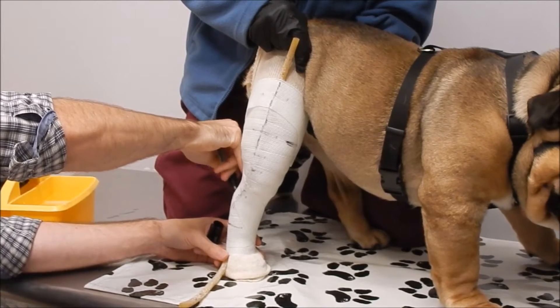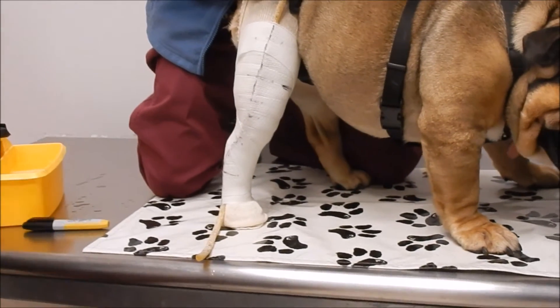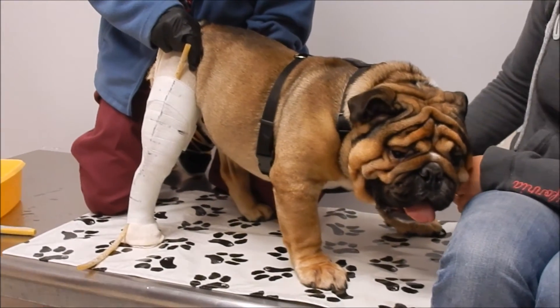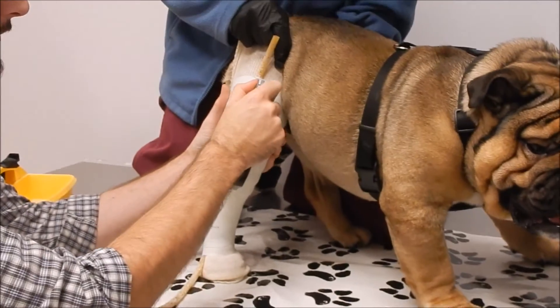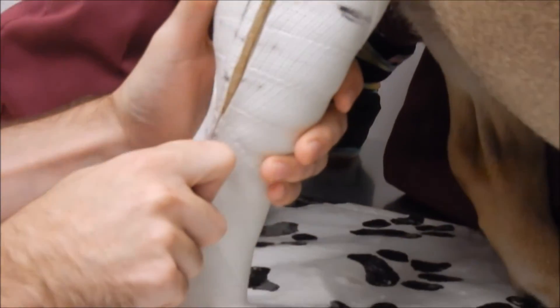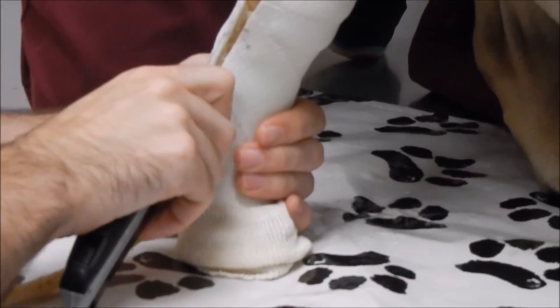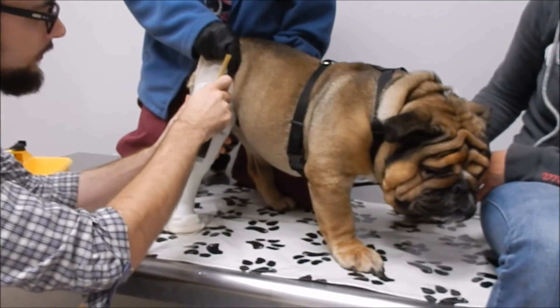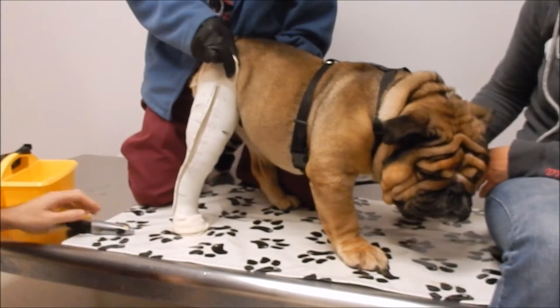If I want to, I can mark the calcaneus as well — the back of the hock. I like to put my thumb right next to the blade so even if I slip I'm not going to poke him too hard. If I did that right, it should be nice and easy to cut through with the utility knife.